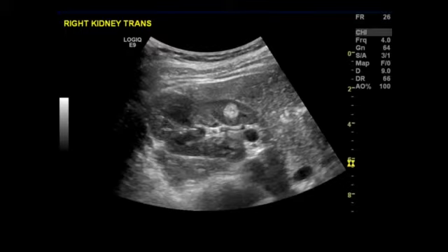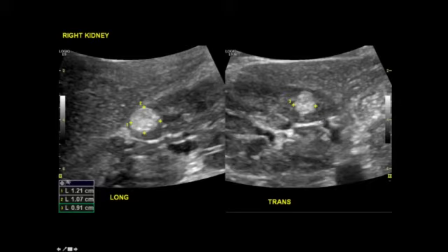Sometimes you see funny things in the kidneys, and here you can see a nice bright little white ring. This is an angiomyolipoma. Now this course isn't about recognizing that, but you should recognize that you sometimes see things that you don't know what they are, and that's when you need to ask for help. So a small renal cell carcinoma is very difficult to differentiate from this. The patient needs follow-up and certainly expert review. So if you see something strange, ask someone about it. So that's an angiomyolipoma. It's a benign tumour, but needs differentiating from an RCC.